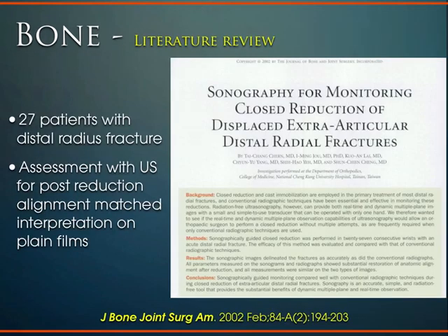And that's true for bone as well. And then as you try to put it into a clinical perspective, okay, great, I can image it and I can see the fracture, but can I use that to then treat the patient? Especially in an emergency room setting, we're doing reduction of fractures and closed reduction of fractures, and there's this one particular study showing that it can be quite successful with that.